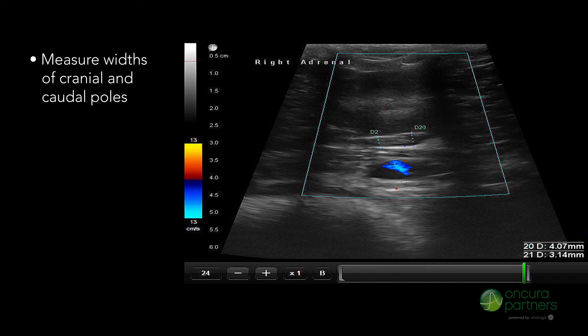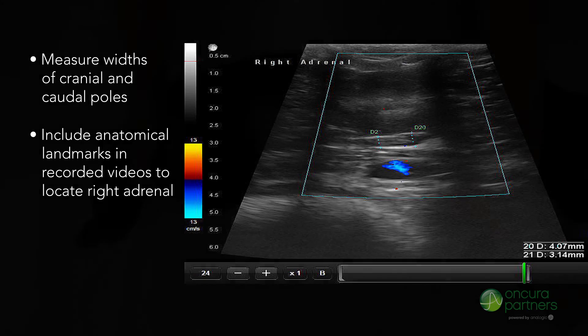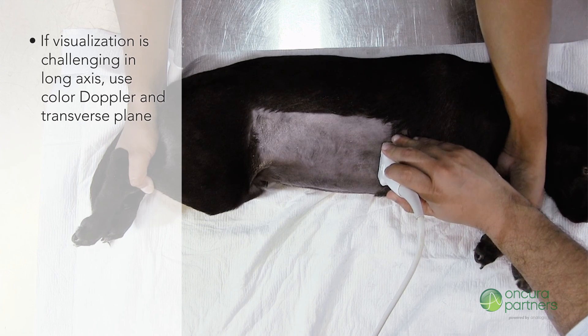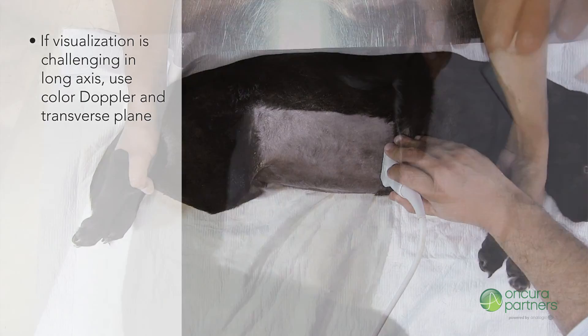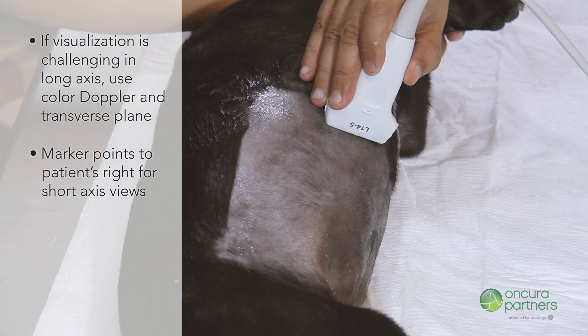It is important that the aforementioned landmarks are included in the recorded videos to achieve a high rate of success in locating the right adrenal. If visualization is challenging in the long axis, use color Doppler and the transverse plane. Ensure the marker is always pointing to the right of the patient during short axis views.